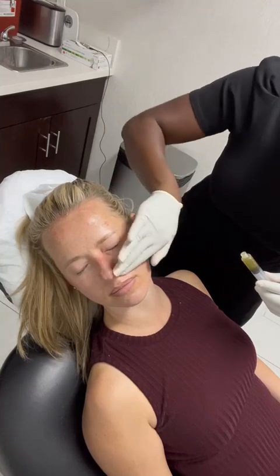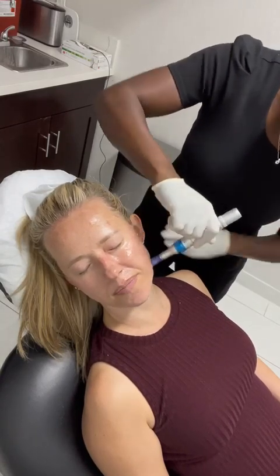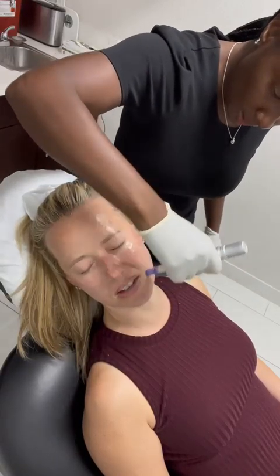This is another client, showing you the different textures and skin colors that can be used with Juventix's microneedling pen and their products and supplies. I'm using their fine microneedles, starting off with 12 and advancing to 36 microneedles based on the client's toleration.